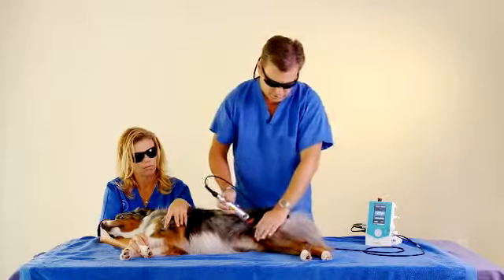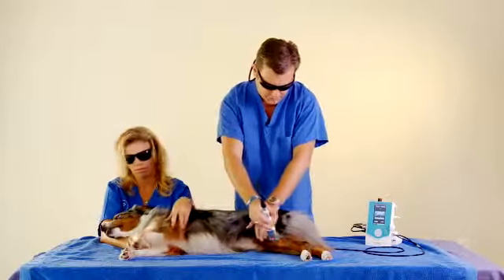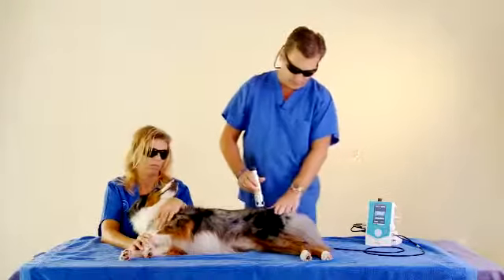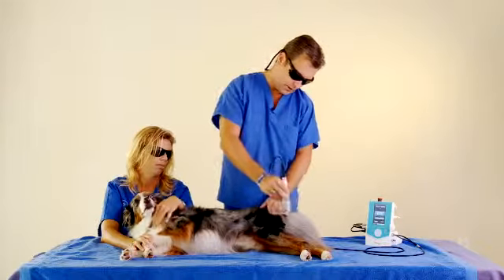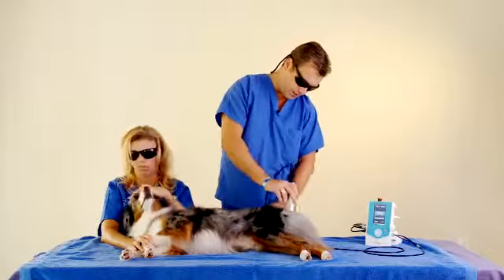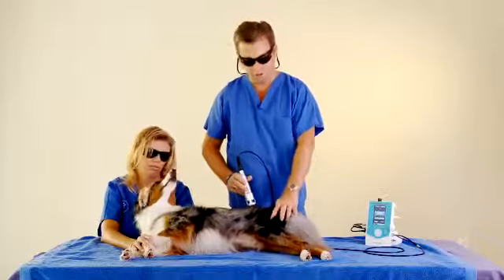Again, if it was a surgery or an injury or fracture, you don't have to touch the patient, but you can just pull the hair back a little bit and paint. For a hip situation, you can again do the same thing, pull this back and paint. And you can do what we're trying to achieve. If you think about this as you're treating, you know your anatomy, you know where that hip joint is, you know where the injury is.